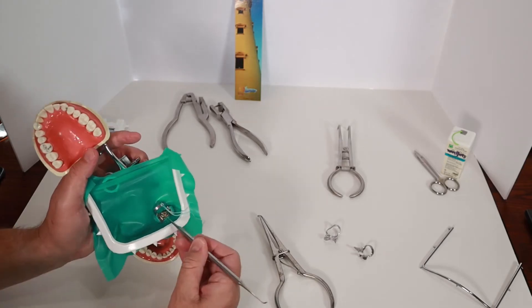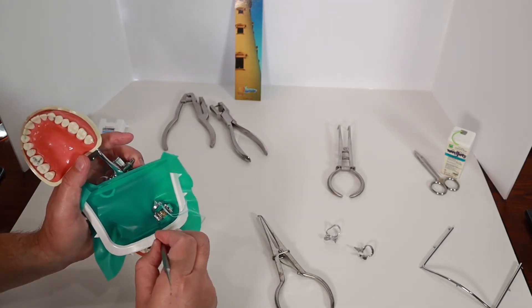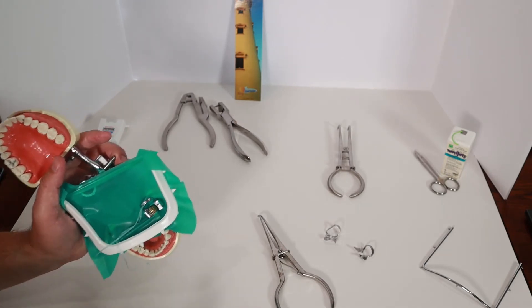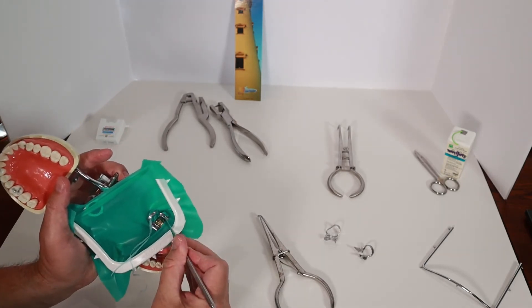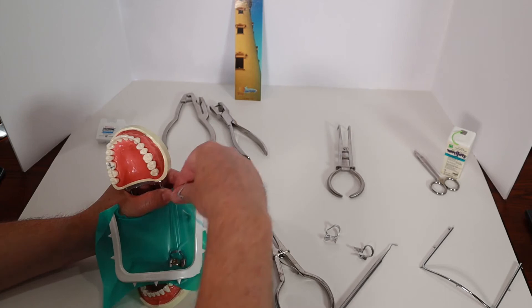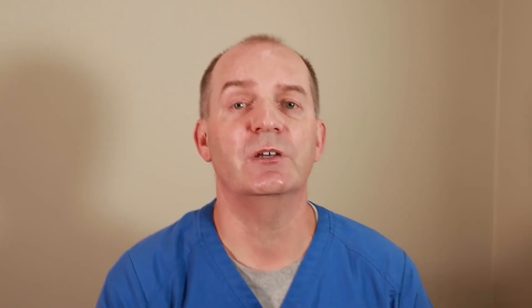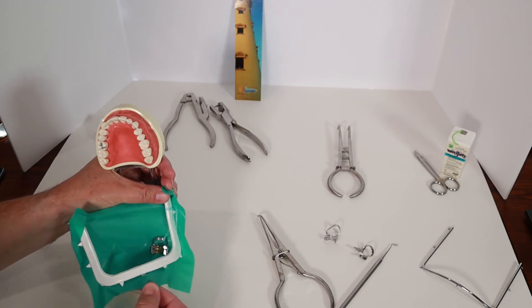Next, I use the dull instrument to tuck the rubber dam under the clip. You can't use a sharp instrument for this step because if you nick the rubber dam, it usually splits wide open and you have to throw it out and start over. Then I wrap the dental floss around the flaring so that if the clip slips off the tooth, it won't go flying across the room or down someone's throat. Then I give the rubber dam a final stretch.